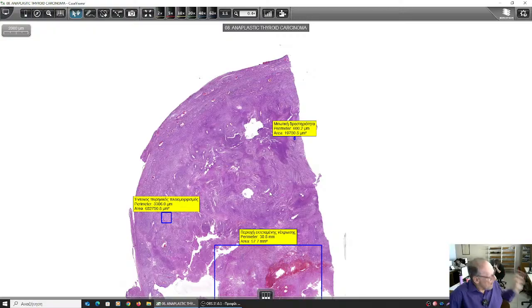Yes, it's cytokeratin, not the one you see in squamous cell carcinoma in hematoxylin eosin sections. This is a morphologic feature. No, you have an antibody against pancytokeratin. You stain the malignant tumor with immunohistochemistry, and so you say it's from epithelial origin, so this is an undifferentiated thyroid carcinoma, or an anaplastic carcinoma with a very ominous prognosis.